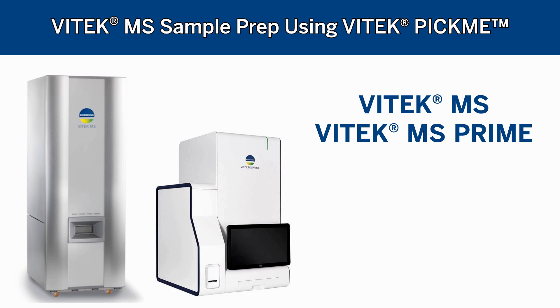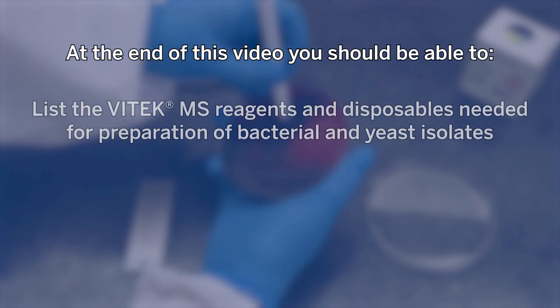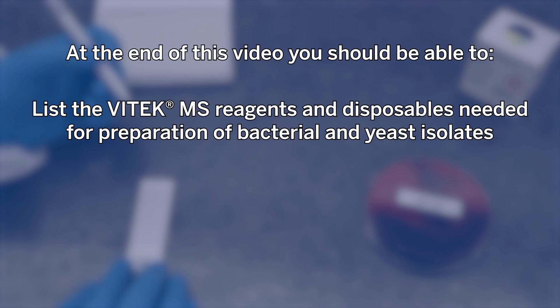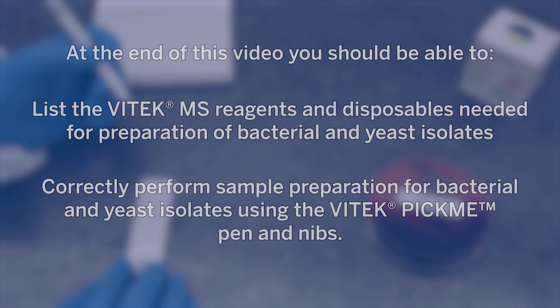This video explains how bacterial and yeast samples are prepared for MALDI-TOF mass spectrometry with the Vitec-MS system using the Vitec-Pikmi pen and nibs. At the end of this video, you should be able to list the Vitec-MS reagents and disposables needed for preparation of bacterial and yeast isolates, and correctly perform sample preparation for bacterial and yeast isolates using the Vitec-Pikmi pen and nibs.